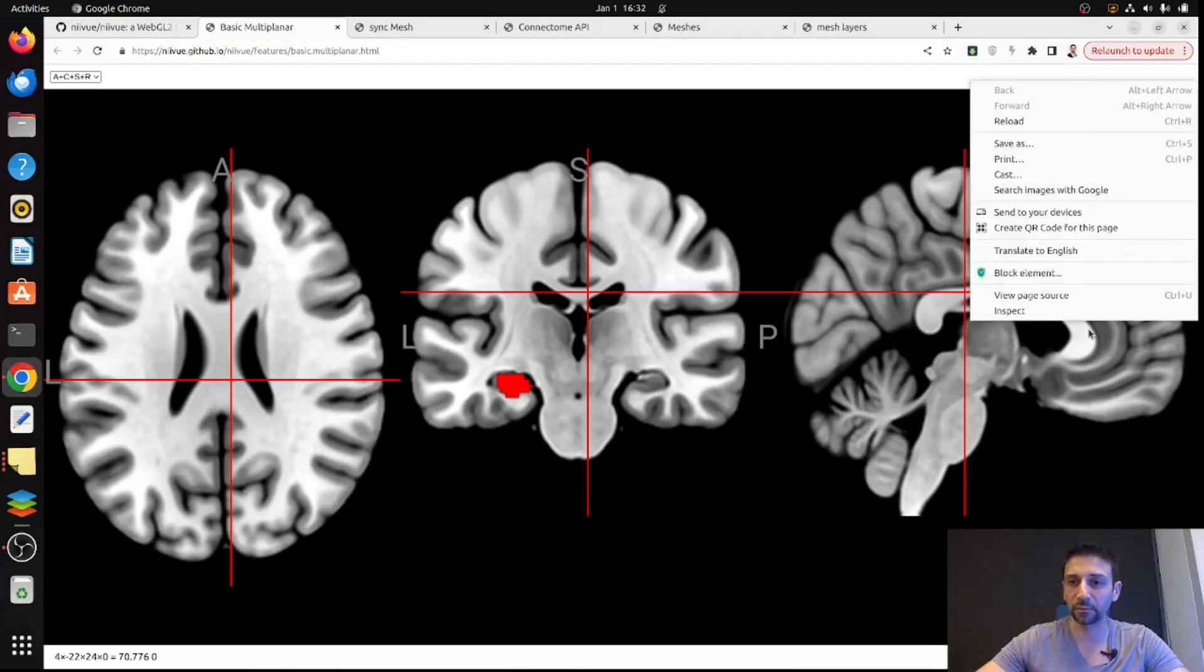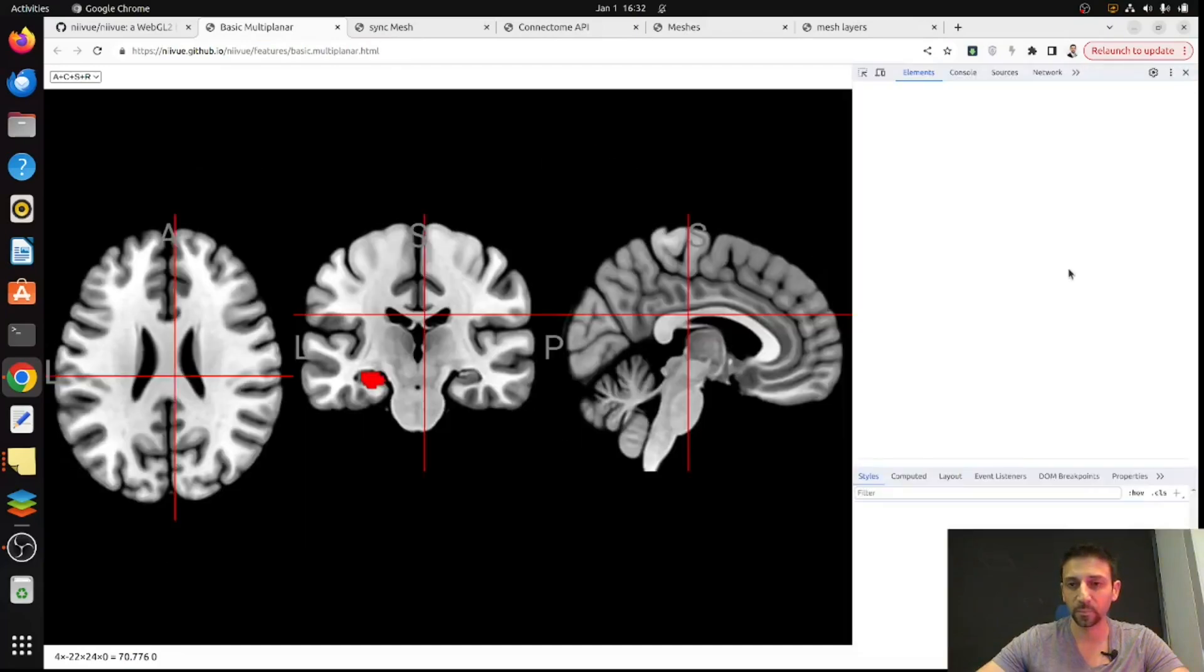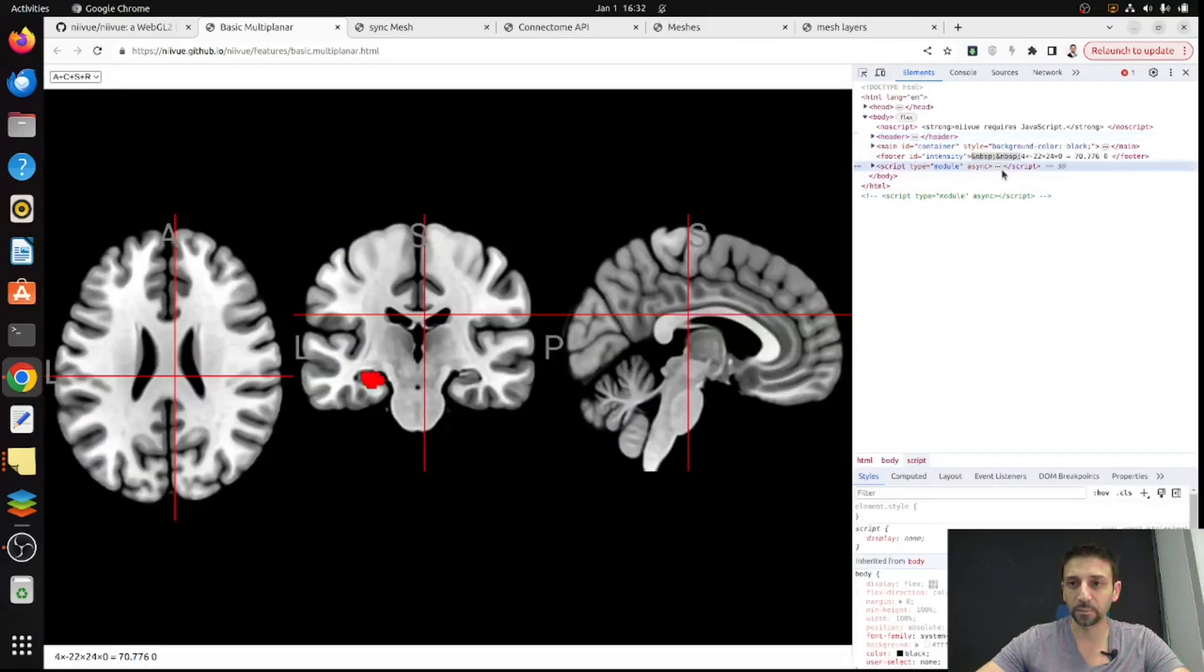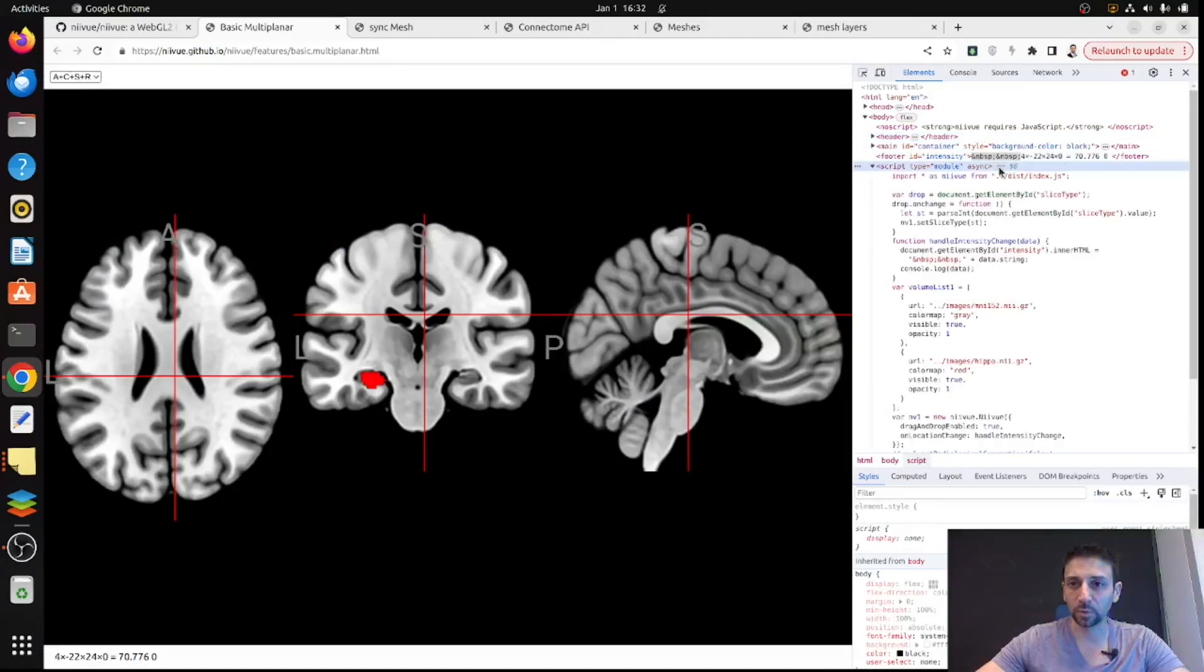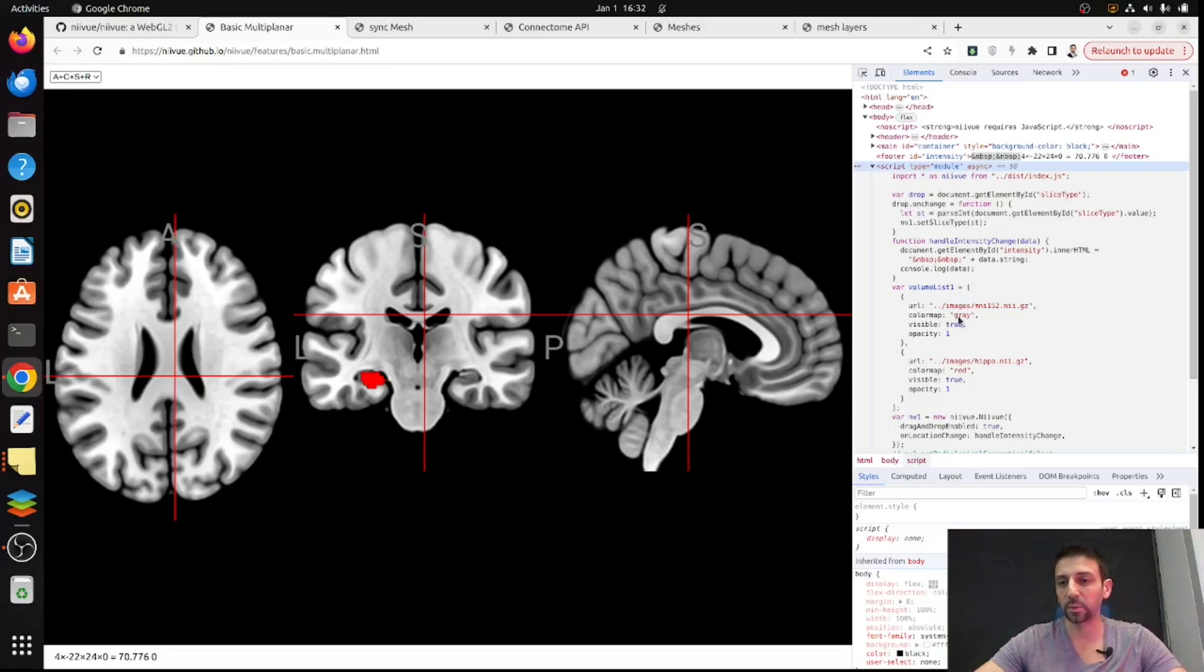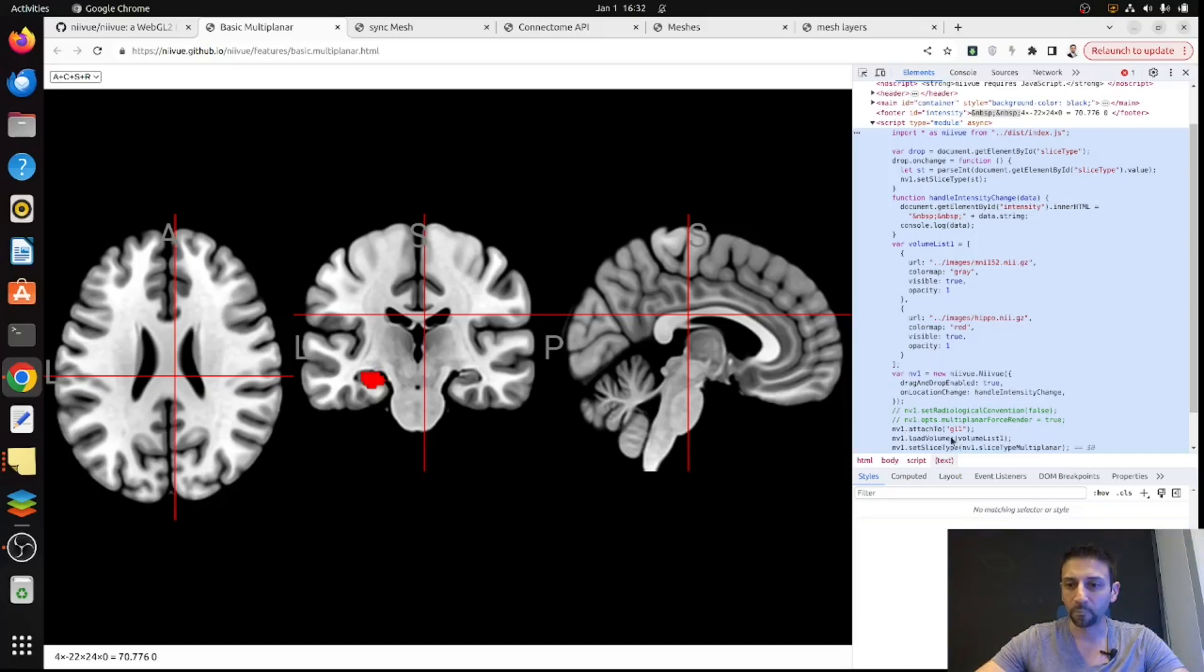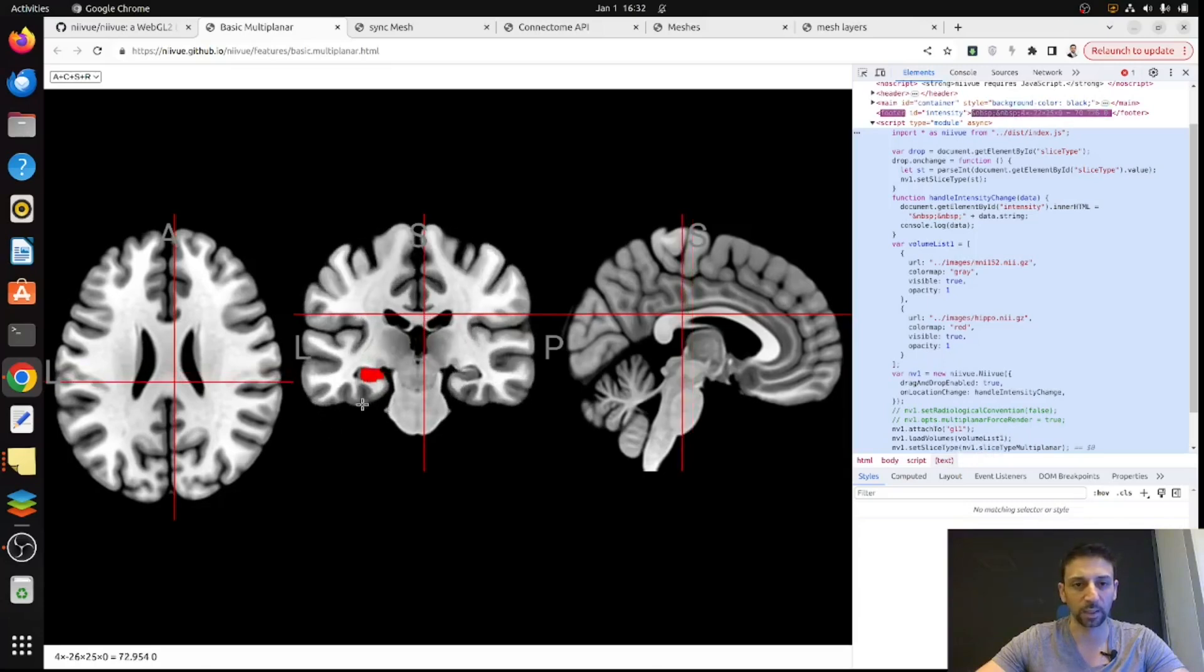To give you an idea how simple this thing is, if I look at the JavaScript and open it here, inside the scripts you have to import the libraries, and then you see everything is in these few lines of code. For example, we can load the nifty file, just the MNI reference volume and then also the segmentation of the hippocampus. Then they are simply added to the visualization and added to the slicer to allow some slicing.